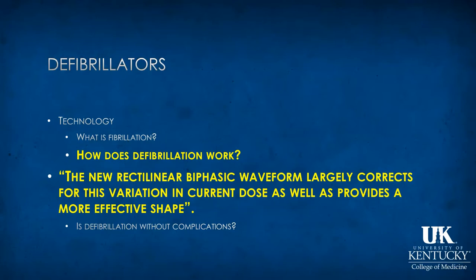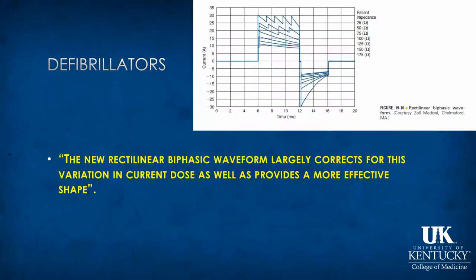It is stated that the new rectilinear biphasic waveform, which is what we have in our Zoll defibrillators, provides a more effective shape for energy delivery, and this is what a rectilinear biphasic waveform looks like. And it is just simply more efficient.